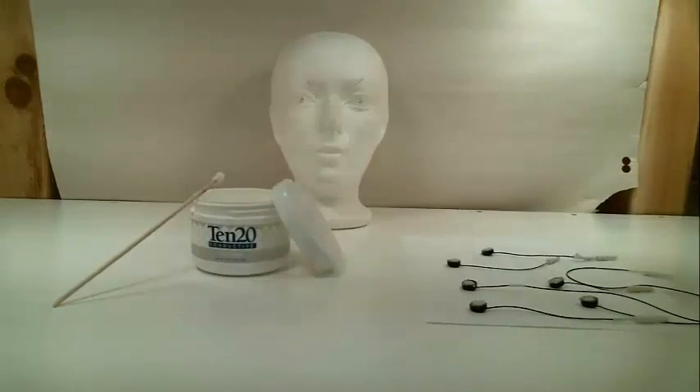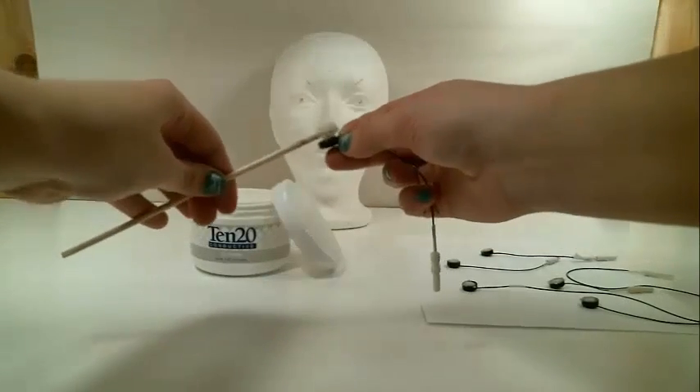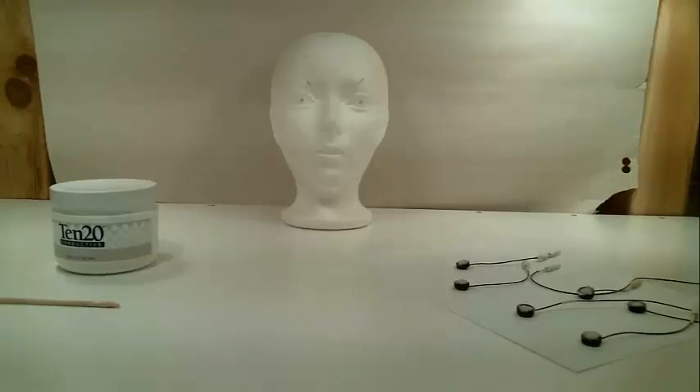First, we will fill the electrodes with a conductive gel. This gel is less soluble in water than other conductive gels, and it helps stick the electrodes to the skin. The gel is filled to the top of the electrode well. It is important that the well is completely filled so that electrical activity is conducted effectively.